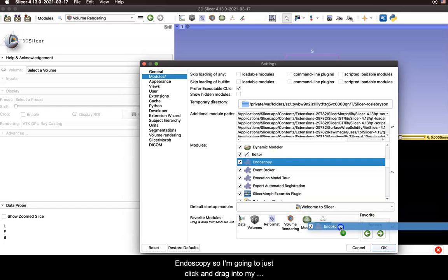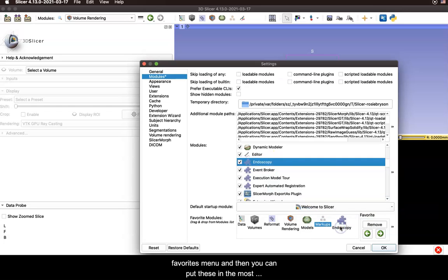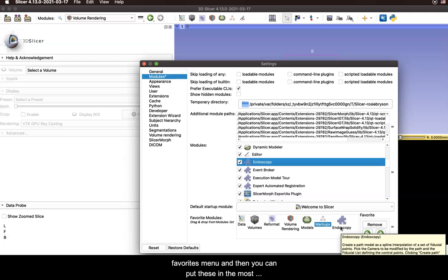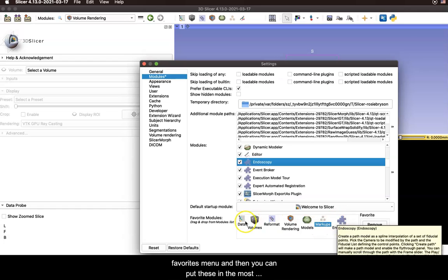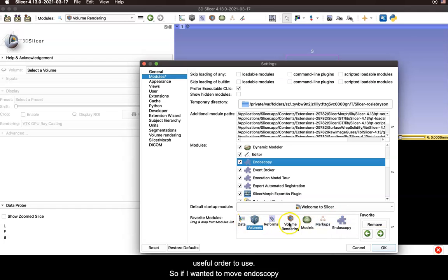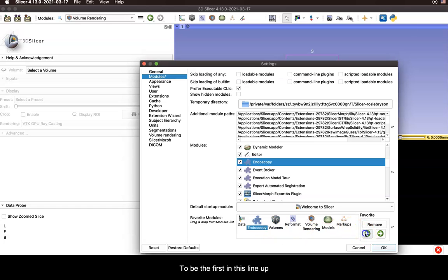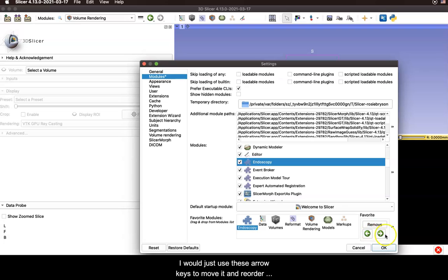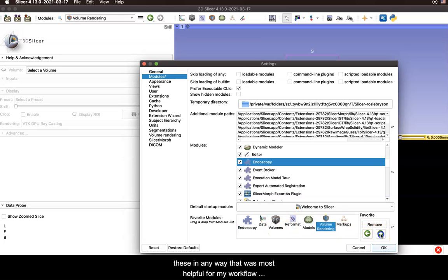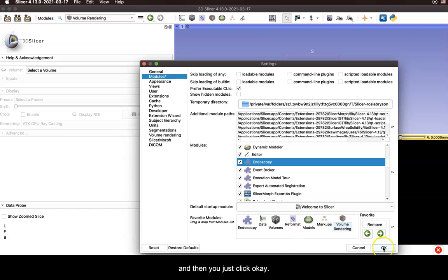So I'm going to just click and drag into my favorites menu and then you can put these in the most useful order to you. So if I wanted to move endoscopy to be the first in this lineup I would just use these arrow keys to move it and reorder these in any way that was most helpful for my workflow and then you just click OK.